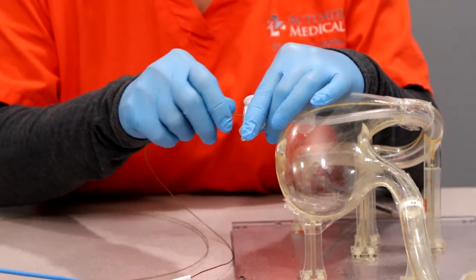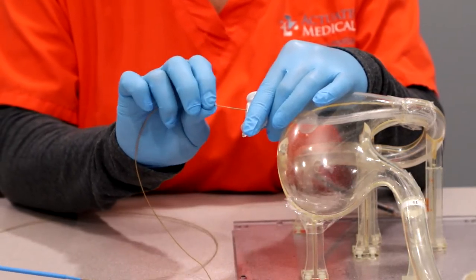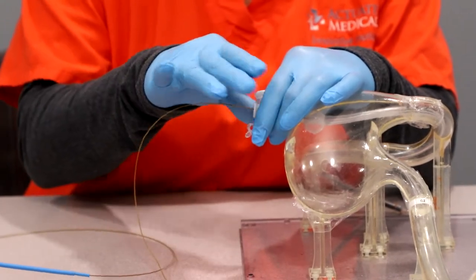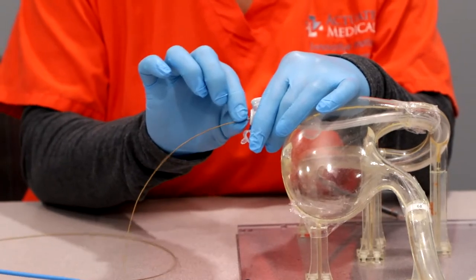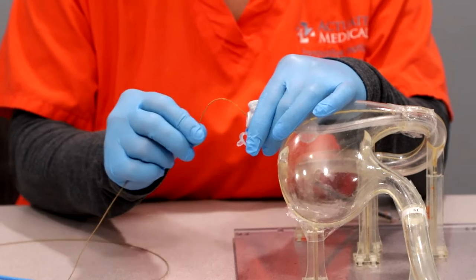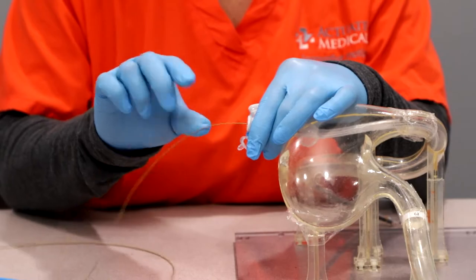I'm going to advance the Clearing Stem as far as I can until it gets kind of hard to push. Once it's there, I'm going to use short, fast, choppy motions. Be sure to secure this button with one hand and keep your fingers as close as possible to this portion so that you don't have kinking. Do not pinch or squeeze the Clearing Stem so that you don't have kinking.